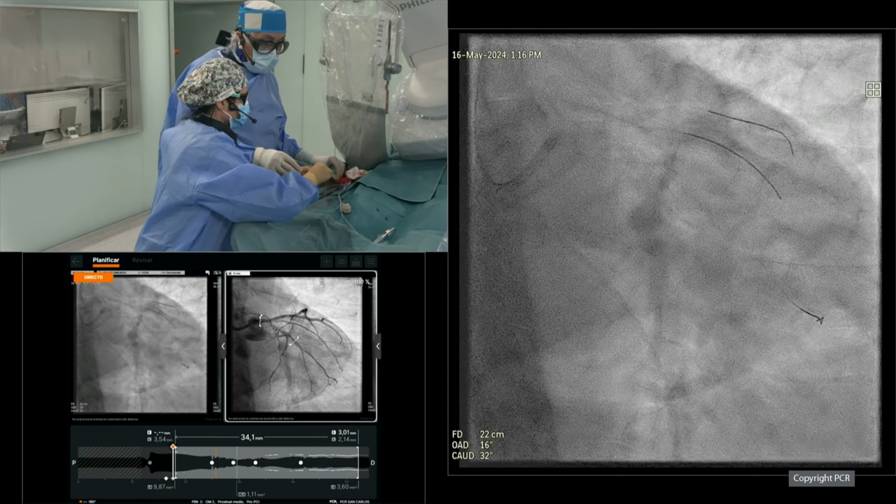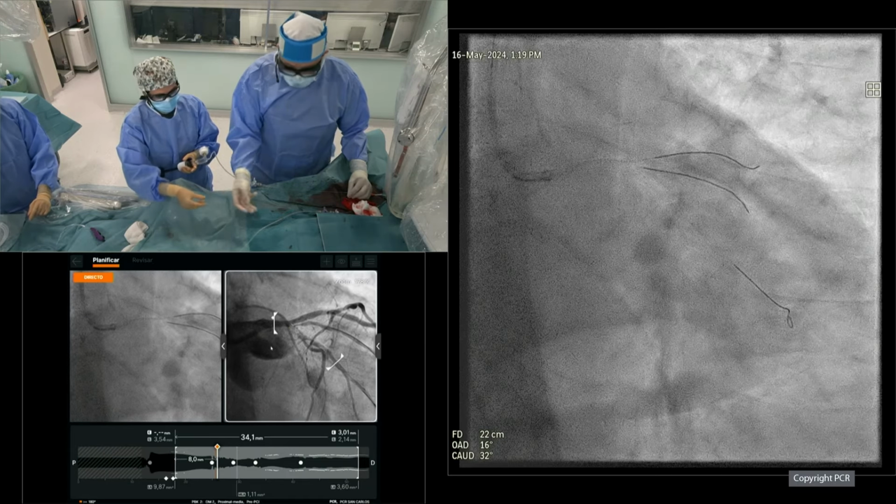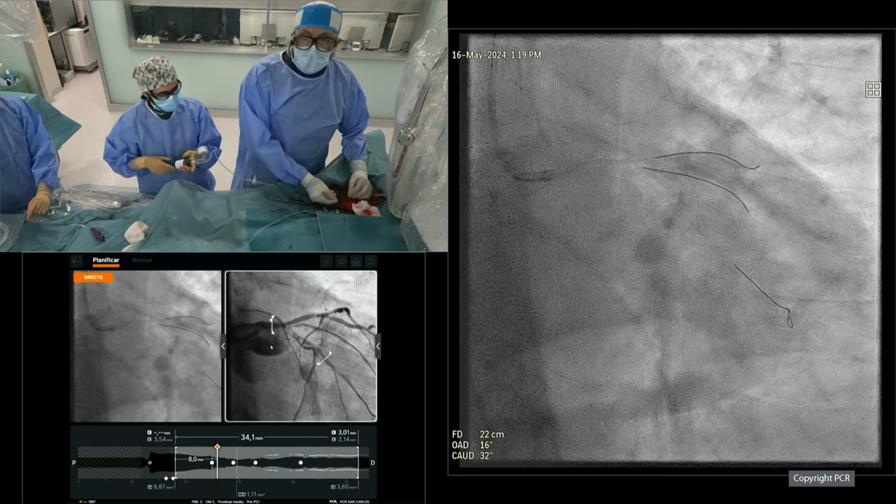So we have the wires. Good. But it could happen, certainly we will recheck, Emanuele. Let me see. Give me the one that is bent, please, it's this one, right? Yes. I just want to reposition these wires a bit. So what we do usually is use different colors if we can, blue and green. And in this case we have two Sions, so one of them, the one in the branch, usually we fold it. Stent boost, please. Stent boost, just as a trick to distinguish them.